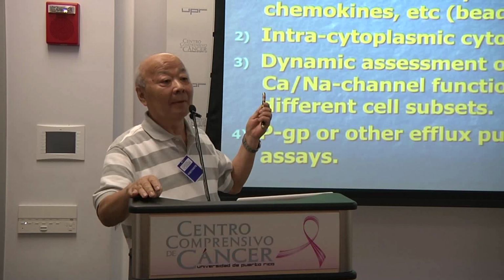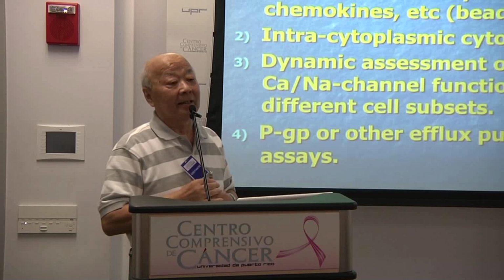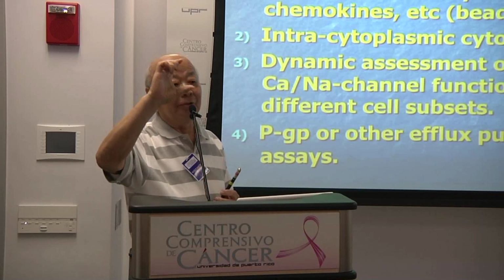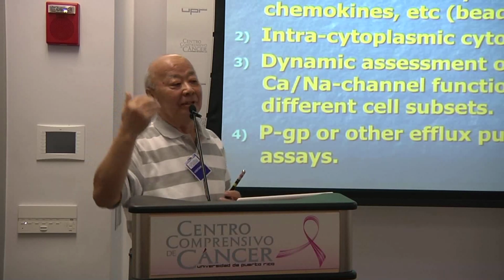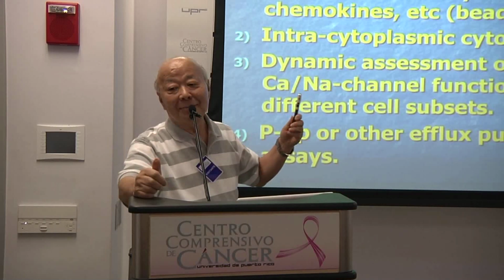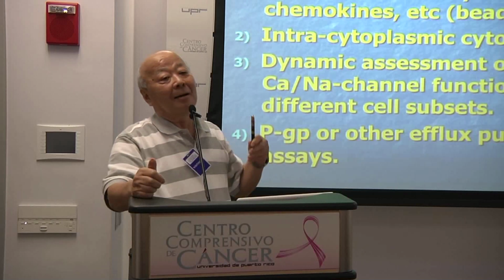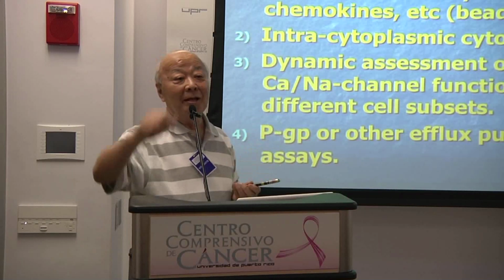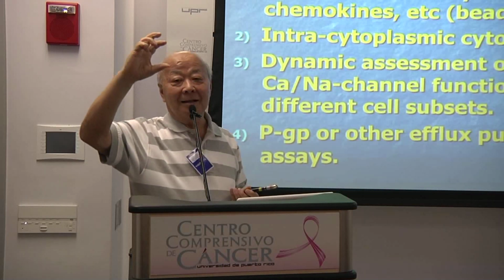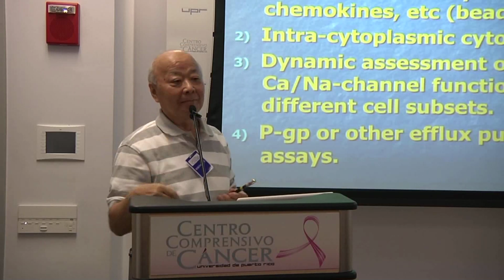Per ml, yeah. But as I said, there are many concentration kits. If you use them, for example, the reason Amplicor goes down to 20 copies per ml is because they use 1 ml of plasma, and all the eluate goes into one reaction.